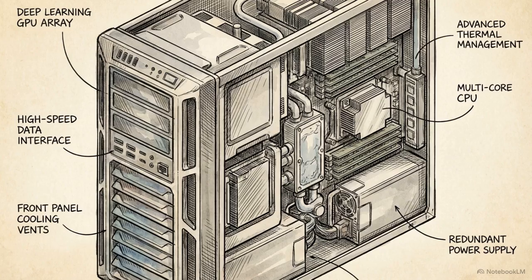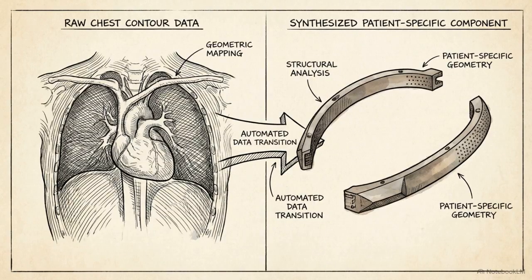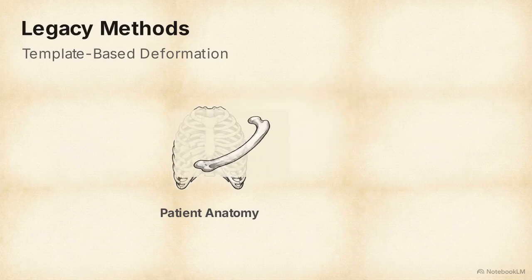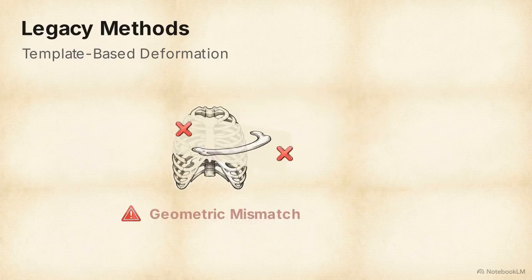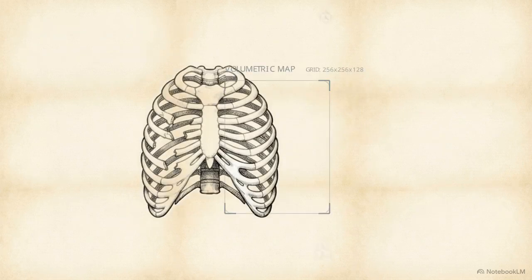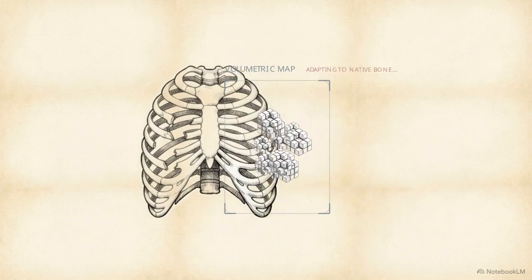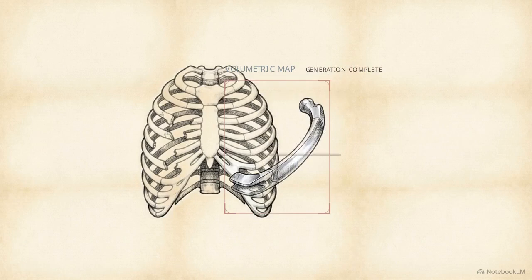Researchers have developed RibCageImp to solve this scaling problem. It is the first fully automated, data-driven deep learning framework engineered to generate 3D ribcage implants directly from patient CT volumes. Previous computational solutions relied on statistical shape models and template-based deformations. By taking an automated volumetric approach instead, the system adapts to unseen anatomical variations, offering consistent, scalable implant generation.